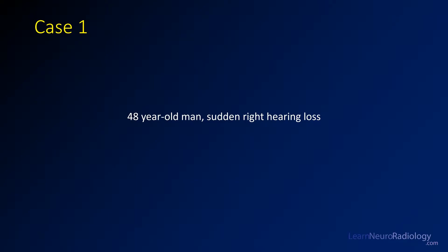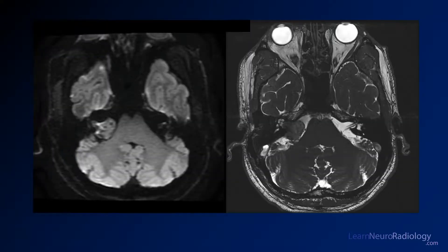For this first case we have a 48-year-old man with sudden right hearing loss. Here are our images. On the left you have a diffusion weighted image. On the right you have a thin slice highly T2 weighted image called FIESTA or CISS. Take a look at that and remember the context of the history.